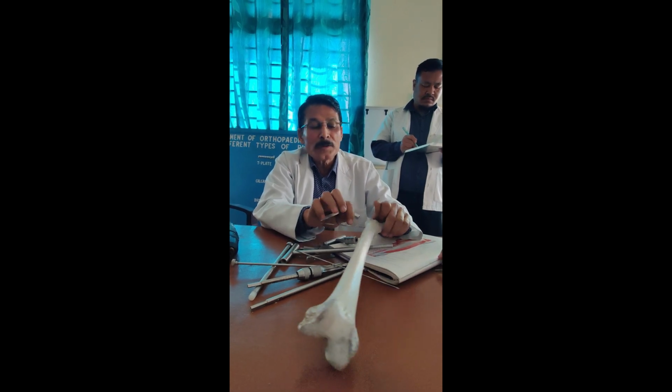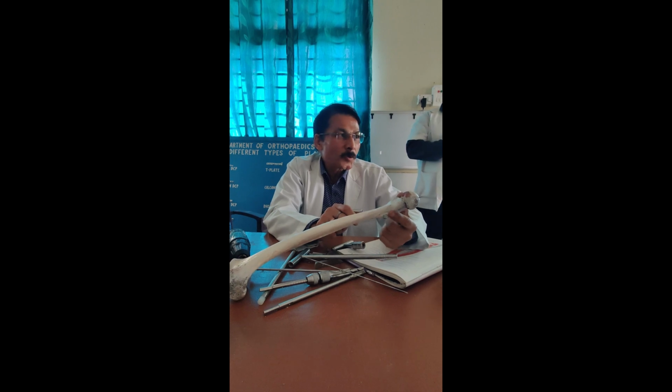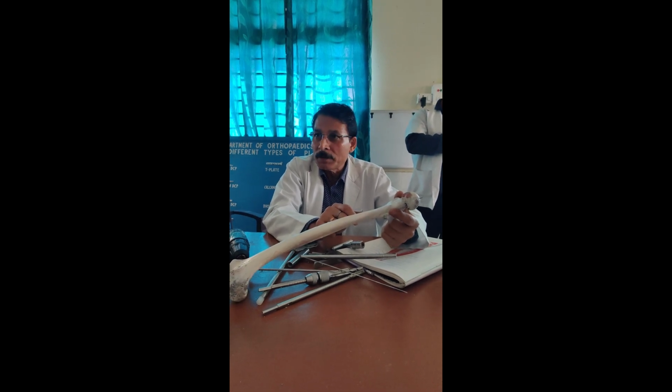Now what are we going to do post-operatively? Post-operatively it is dependent upon many things. One, during the operation, how was your feeling of fixation? A very good surgeon can have a very good fixation. And what about the integrity of the posteromedial part particularly? What is the condition of the bone? Osteoporotic, non-osteoporotic.